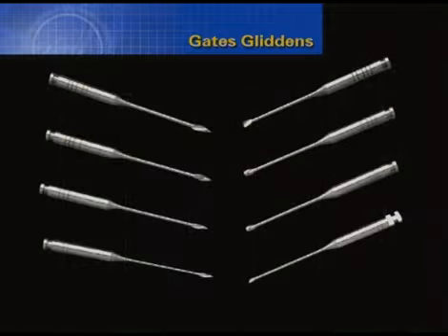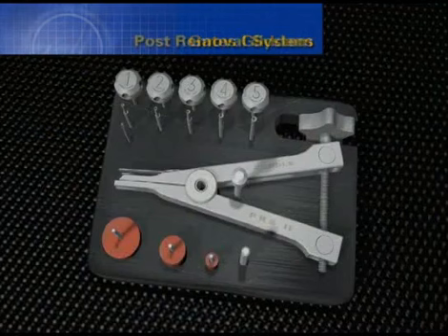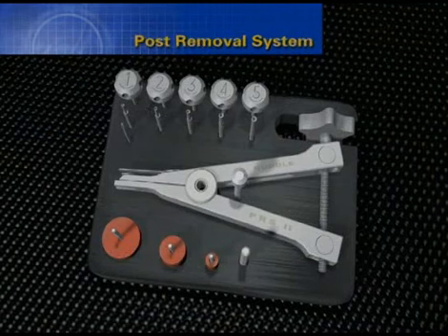If greater access is required lateral to the most coronal aspect of an obstruction, the butt of a GG can be modified, as shown on the right, and then used to create a circumferential staging platform. The staging platform is made by selecting a GG drill whose maximum cross-sectional diameter is slightly larger than the visualized instrument.